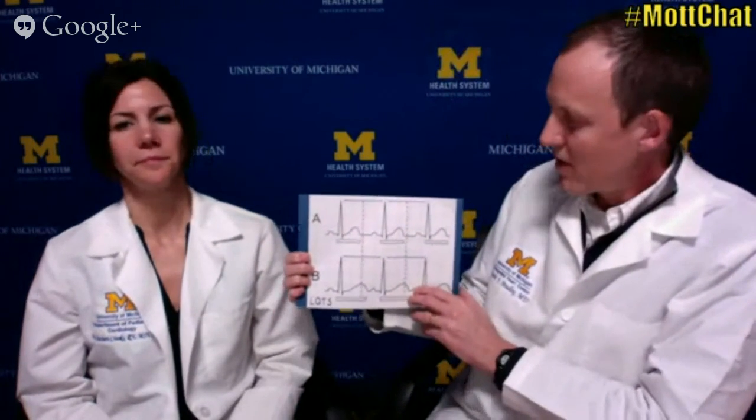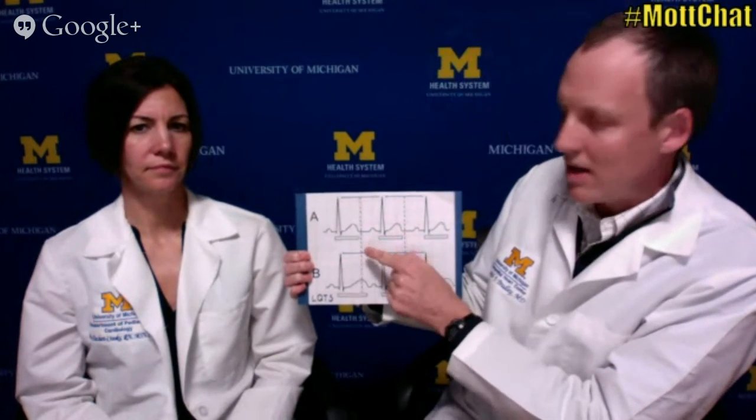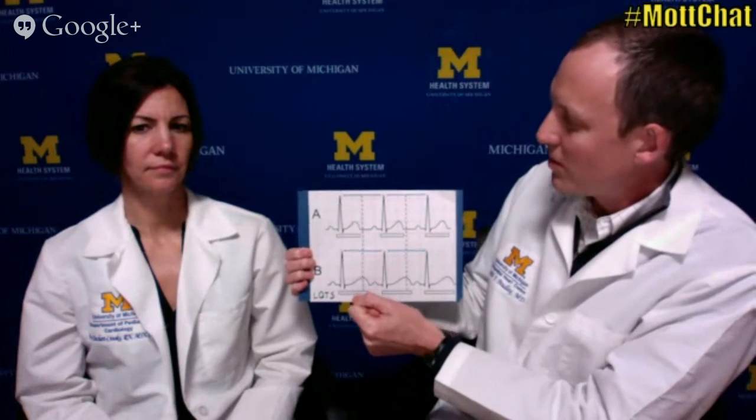So the first one is called long QT syndrome. Long QT is abbreviated LQTS. Long QT refers to a finding on the electrocardiogram. So I'm going to show you a little example of those heartbeats that I think we've all seen in some context. Here in row A is what's considered a normal beat. The big spike is the bottom part of the heart beating, and what follows is the T wave. This little bar shows you what we measure as the QT interval.